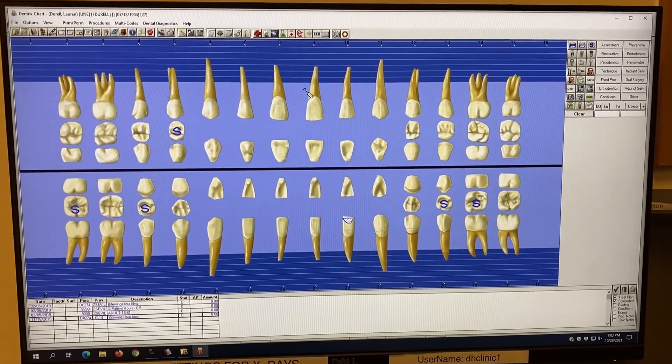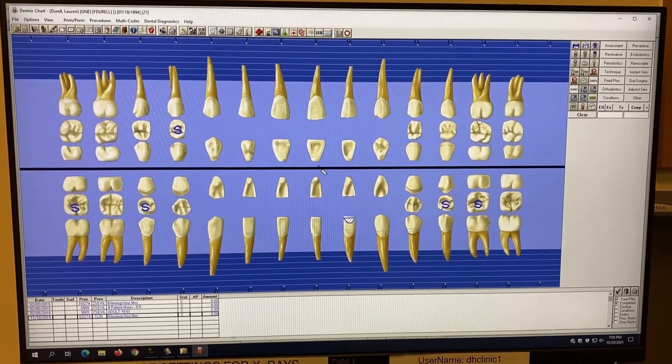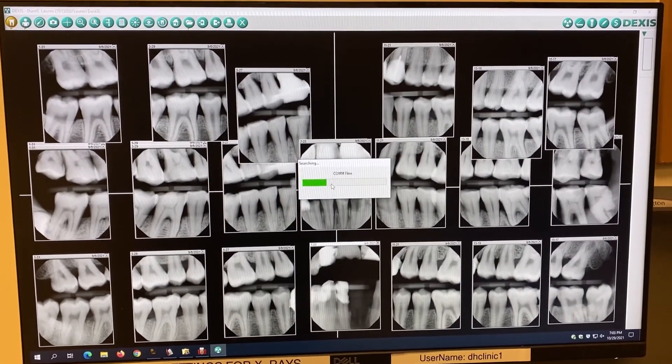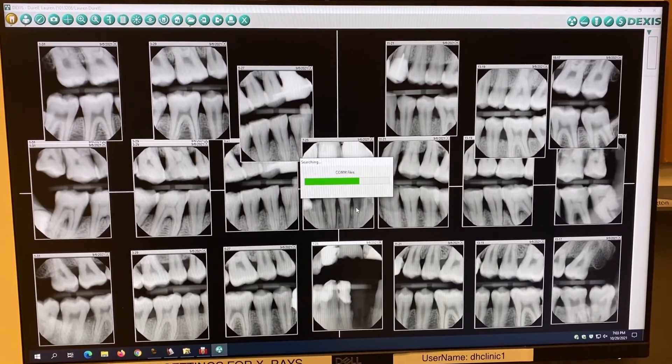Once you have your patient chart open, go to the Acquire X-rays button and click on it. This is going to open up your DEXIS suite and load your COMM files. This could take a little while depending on how many of those you have in your file.